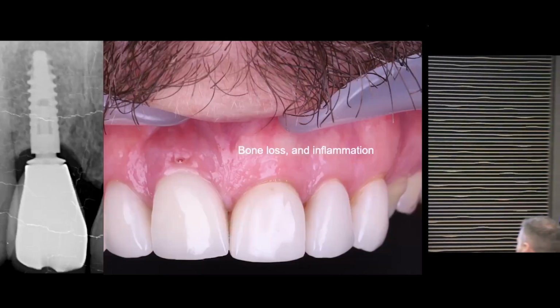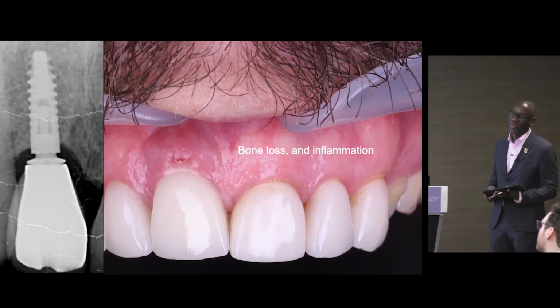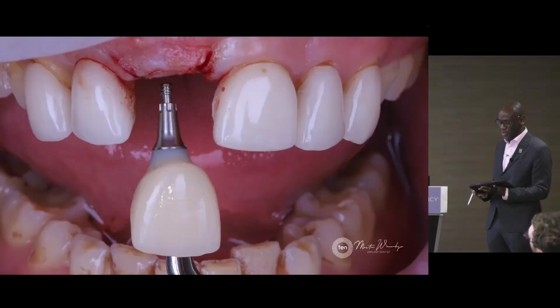Is this a case which we've had to treat in the practice where the wrong collar height has been used? Yeah. And we can see how actually when that comes out and it breaks all of the rules, I think there's a bit of cement underneath there. The patient comes in and that tooth is unsightly. You can see the area where we've had an issue just above the gingival margin there. We've got bone loss. So unfortunately for this poor patient, we have to go through all of that to reconstruct, to get the right shape of tooth in.